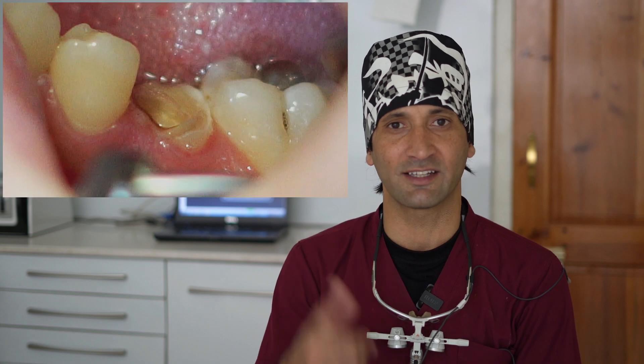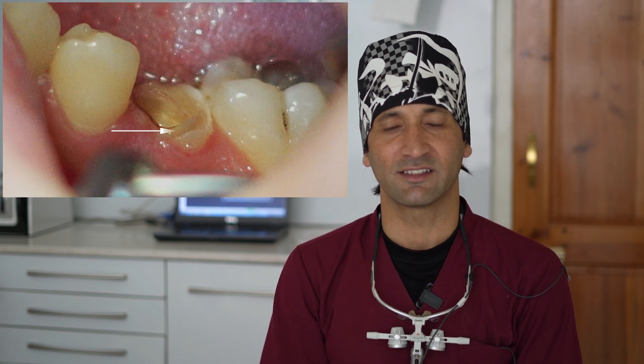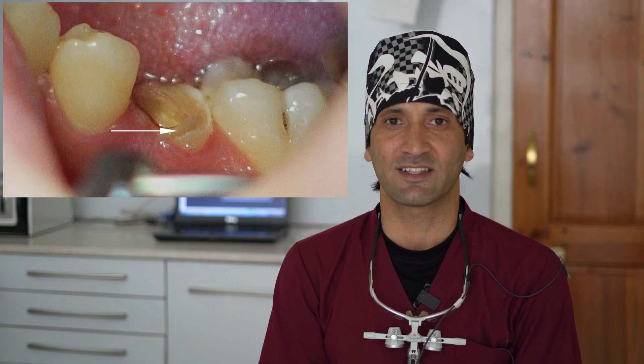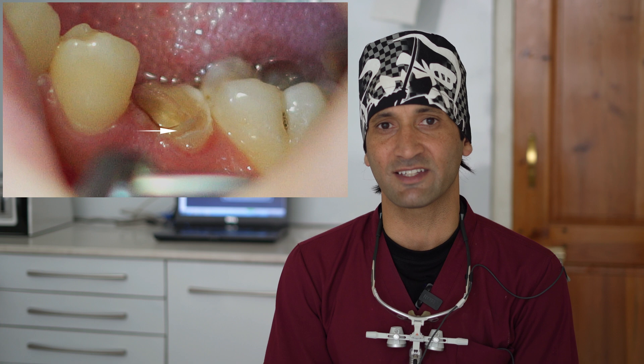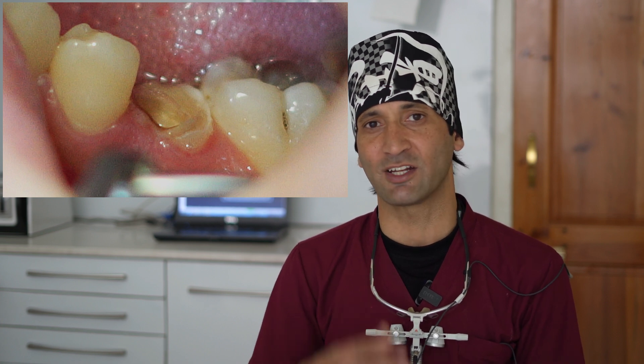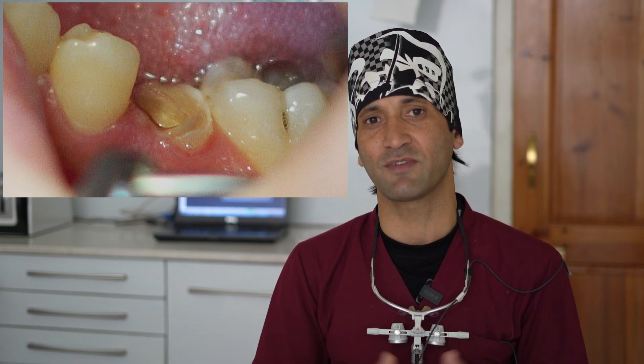First of all, have a look at this tooth — only one to two millimeters of tooth structure is left above the marginal gingiva. I discussed with the patient that I will go for the endodontic procedure, the root canal treatment, first. After that, we will go for the post and core system, which supports the prosthetic process when you are going for crowns or a bridge on that tooth. The patient agreed and I started the procedure.